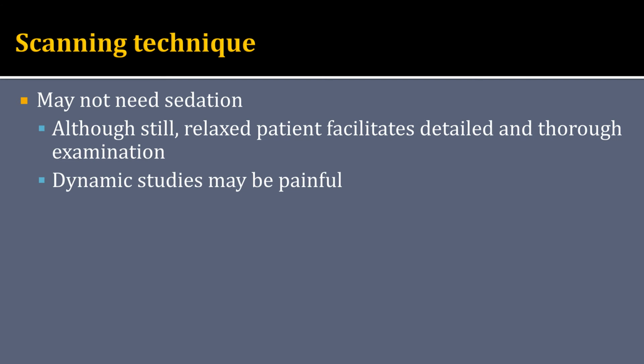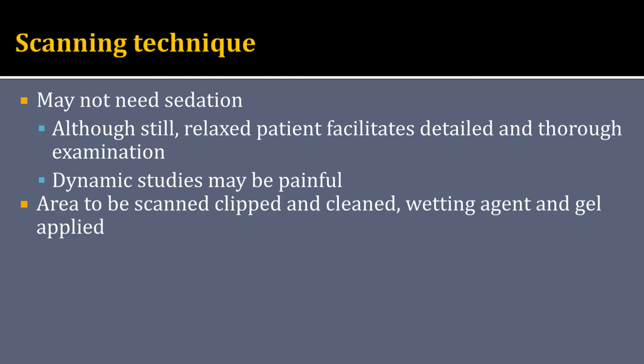We may or may not need any sedation. I do want to caution you that a still and relaxed patient does definitely facilitate detailed and thorough examinations, and some of our dynamic studies may be painful as we put the patient through range of motion, so I do like to have some sedation to help us with our imaging.